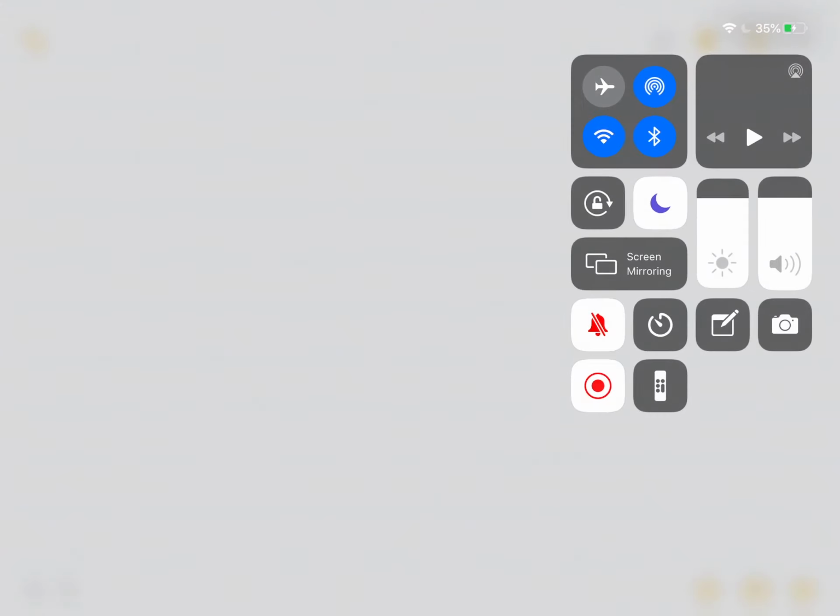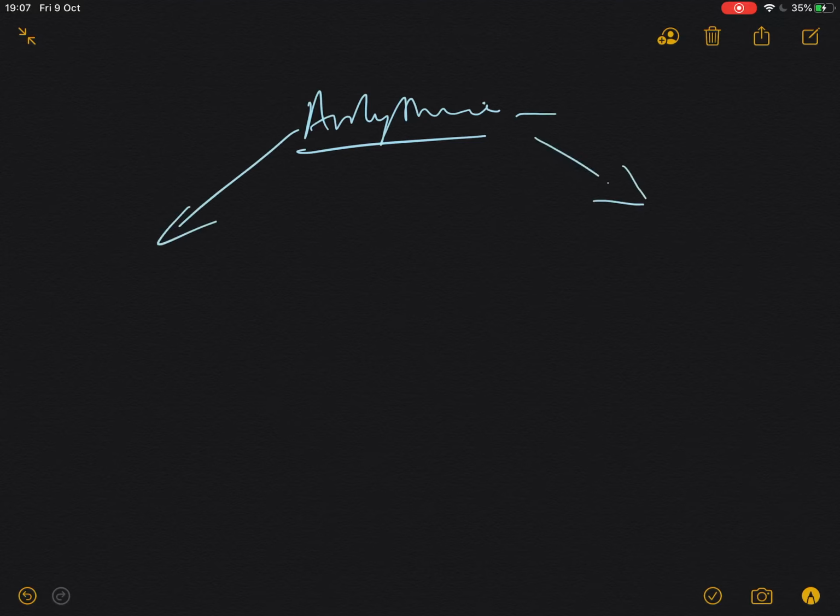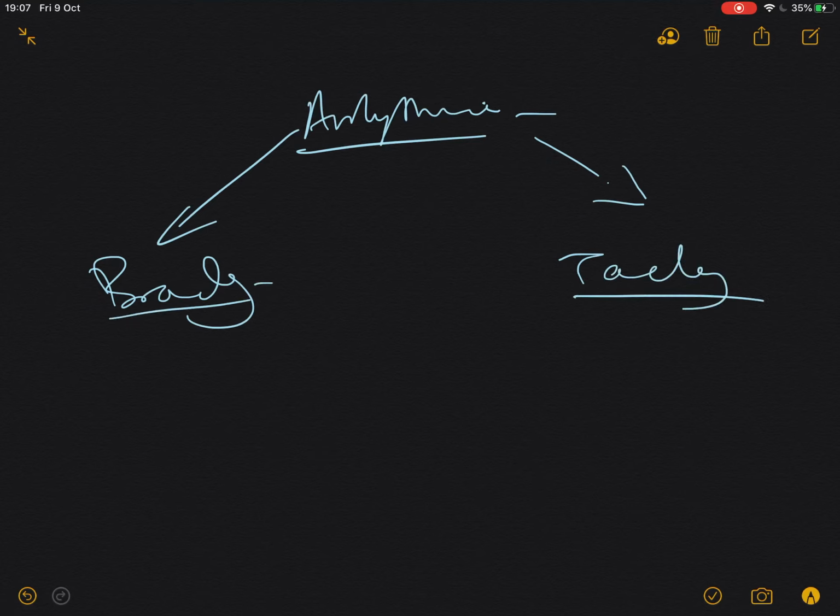Okay, so we're going to quickly go through tachycardias. As a quick recap, this video is on narrow complex tachycardias. We're just going to quickly remember the arrhythmias. So we have a brady, which is less than 60, and we have a tachy, which is greater than 100.